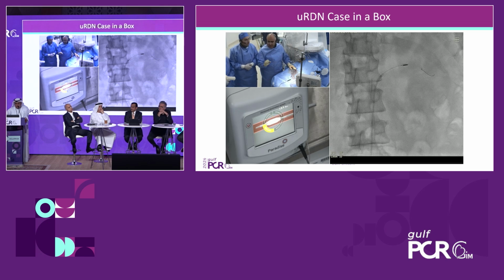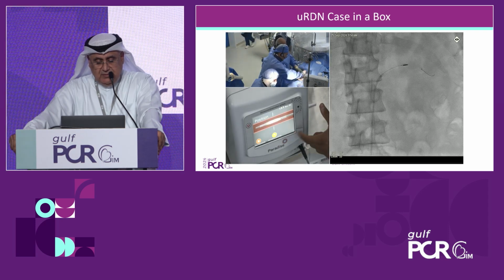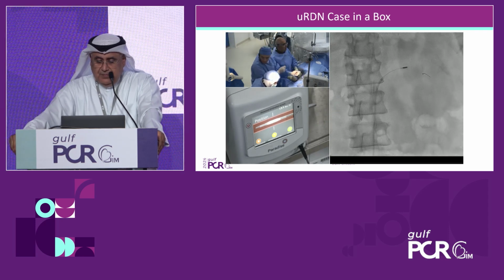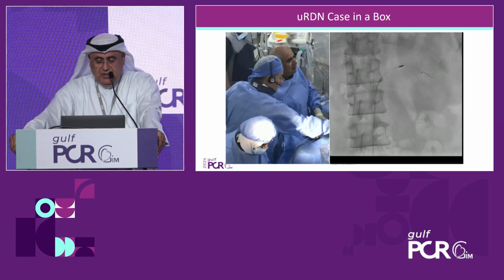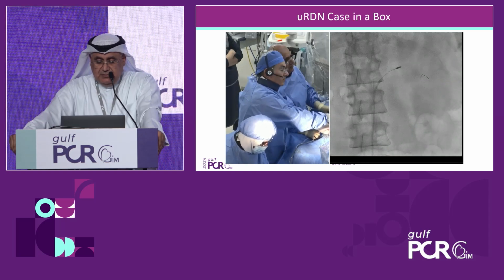So as we can see on the monitor, very clear. After giving the 7 seconds of ablation, then we go to the deflating or post-cooling and then deflating. So it goes automatically. You have to do nothing here. Give it time. No rush. And then I'll go back. If we have an accessory artery, it has to take only one sonication as per protocol.